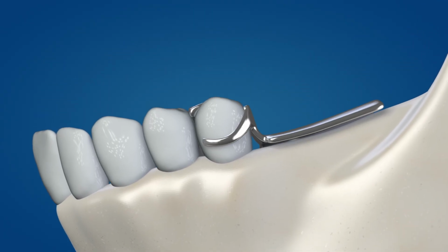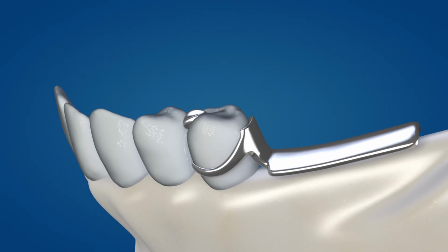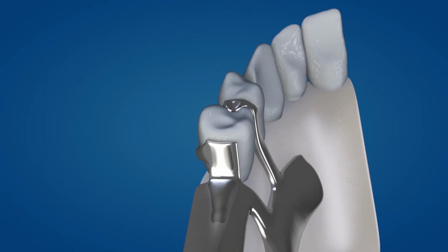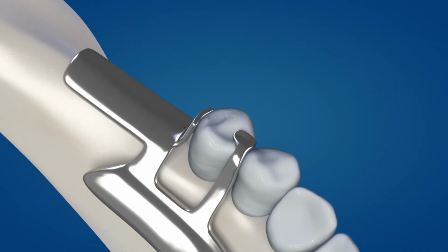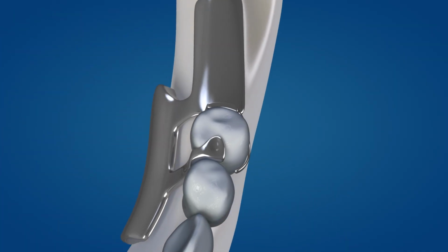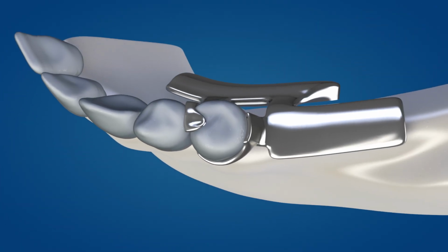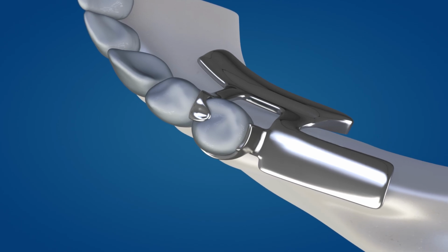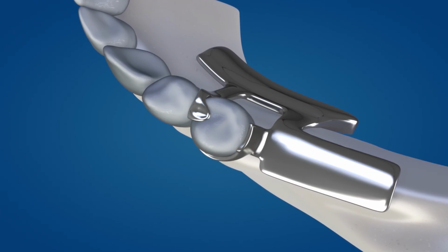As noted for I-bar and RPI assemblies, the RPA clasping assembly requires meticulous attention to detail. Components must be correctly designed and properly positioned. Moreover, laboratory personnel must understand critical elements of prosthesis construction and how these elements will impact the resultant clasp mechanics. If properly executed, the RPA assembly represents another tool in the provider's arsenal. If misunderstood or poorly executed, this clasp assembly can be destructive.